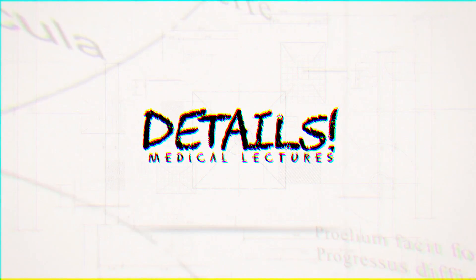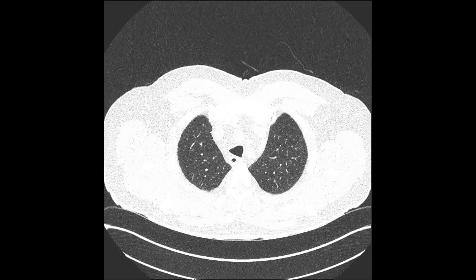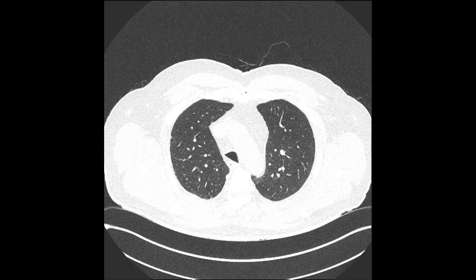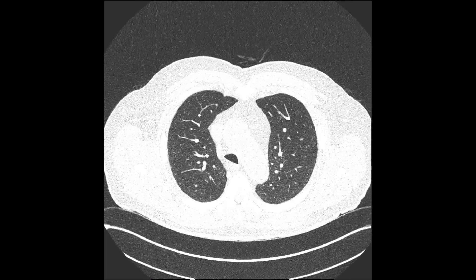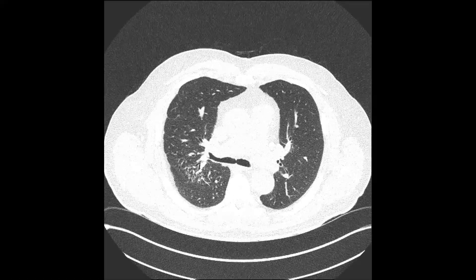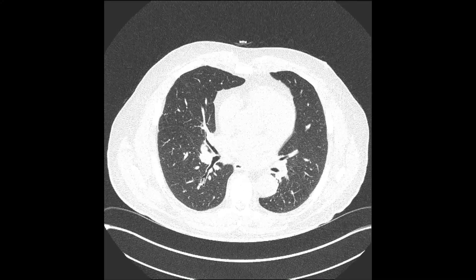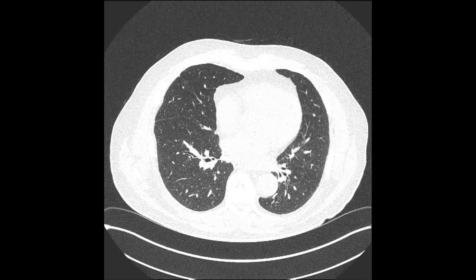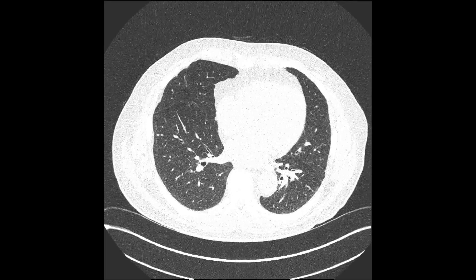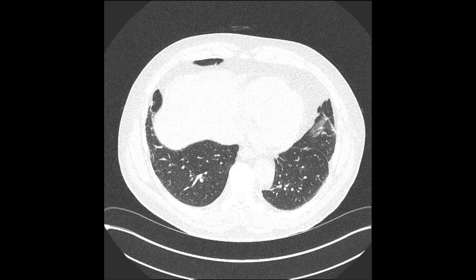This is a CT scan of a patient with stage 2 sarcoidosis, meaning the sarcoid is present in the parenchymal tissue with lymphadenopathy. Stage 1, on the other hand, is just the lymph nodes enlarged. Stage 3 is the lung parenchyma infiltration by itself.